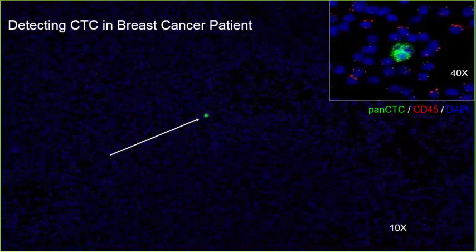This sample is peripheral blood from a breast cancer patient stained with pan-cytokeratin and CD45. The CD45 RNA molecules in the white blood cells appear as red punctate dots, while the cells with green signal are the circulating tumor cells with high expression of pan-cytokeratin, and RNA molecules seen as clusters and clumps.